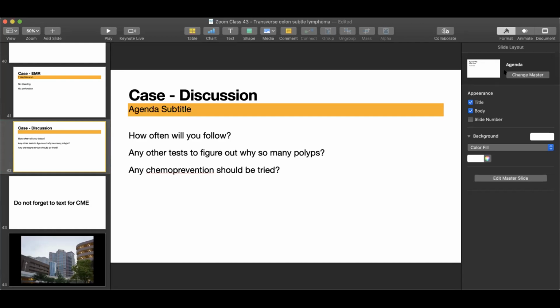But when you have the right colonoscope, you can do it with the comfort of the patient and your own comfort, and then you can make the right endoscopic diagnosis. You're the kind of thought leaders who should push for these things. In this day and age, with so many screening colonoscopies being done, and many more to come, and with flat lesions being identified more and more, I see no reason why every colonoscope should not have these capabilities of near focus, and you should push for these things. They won't listen to the lesser mortals.